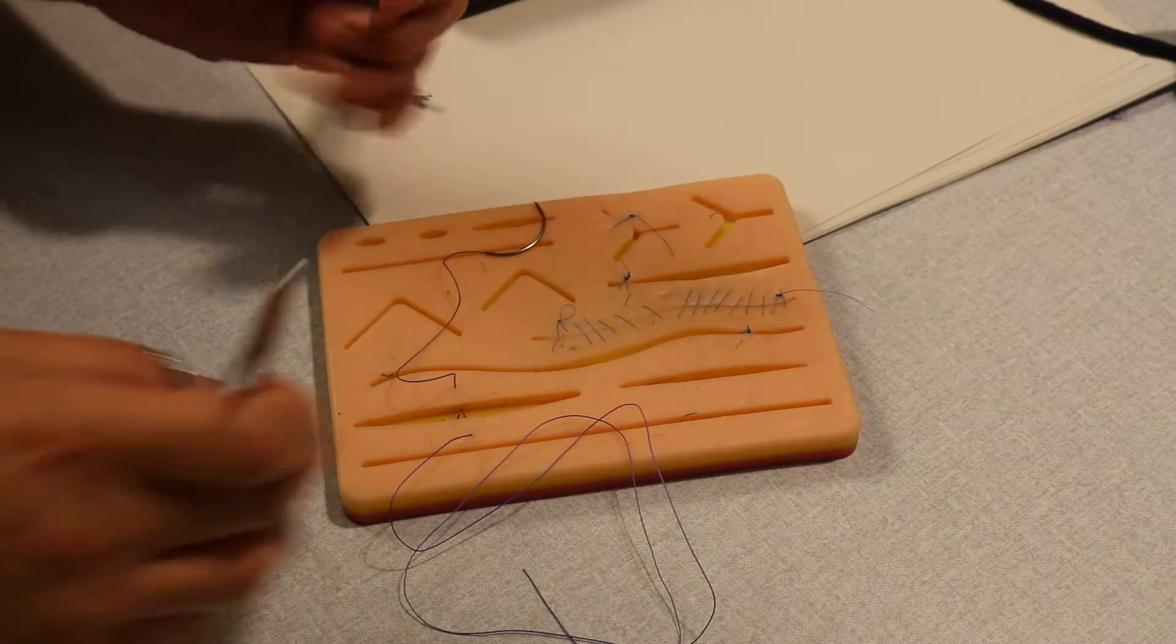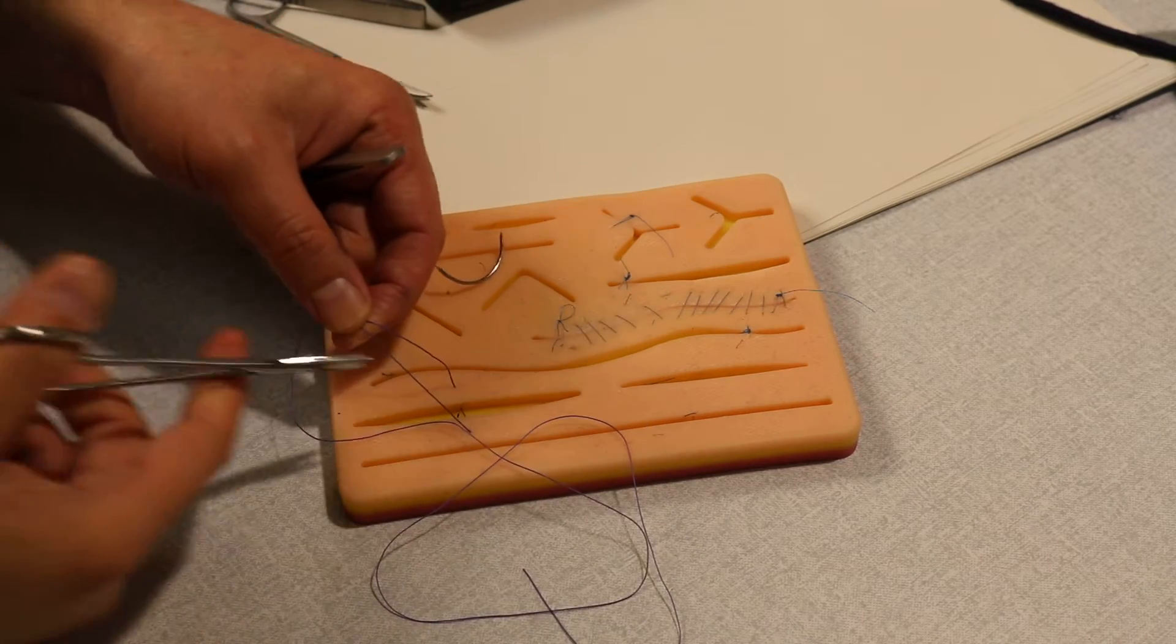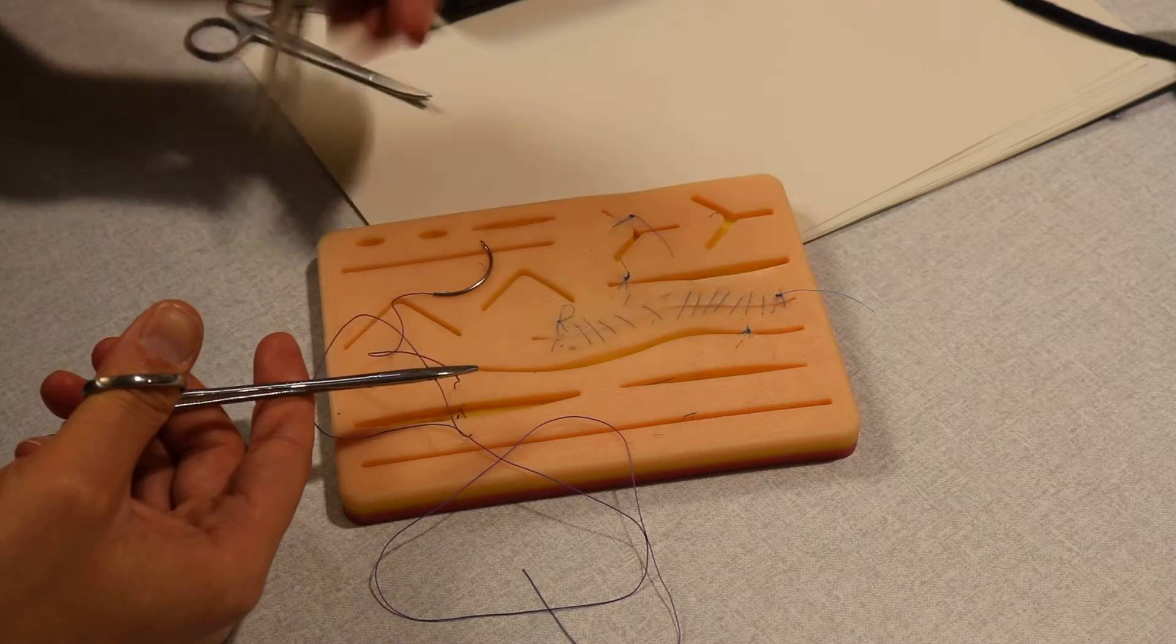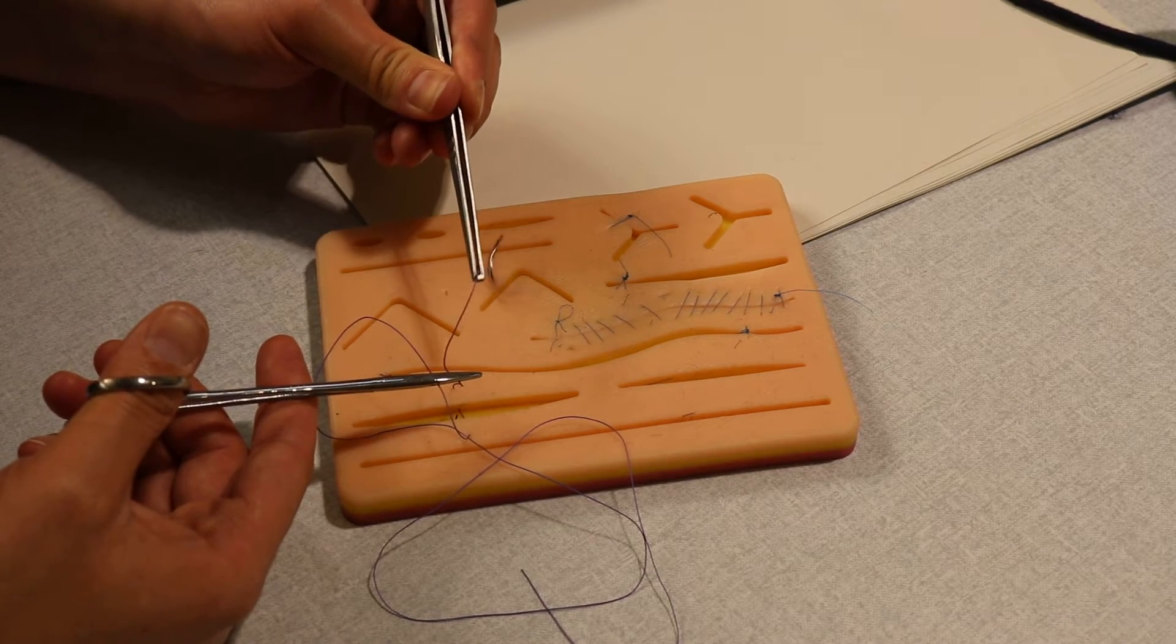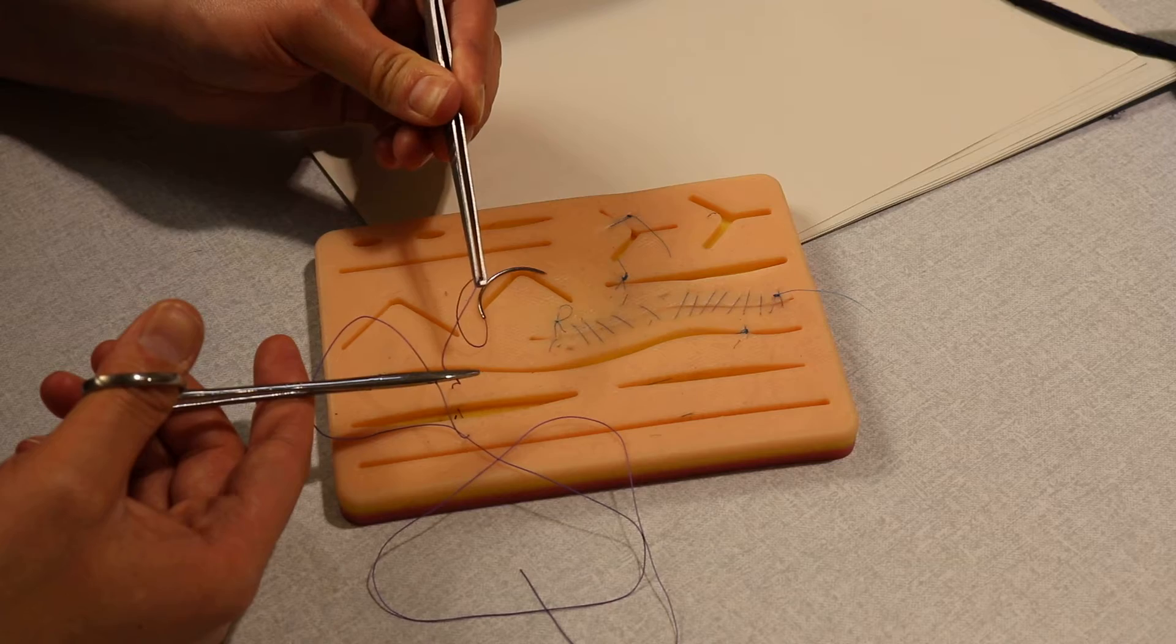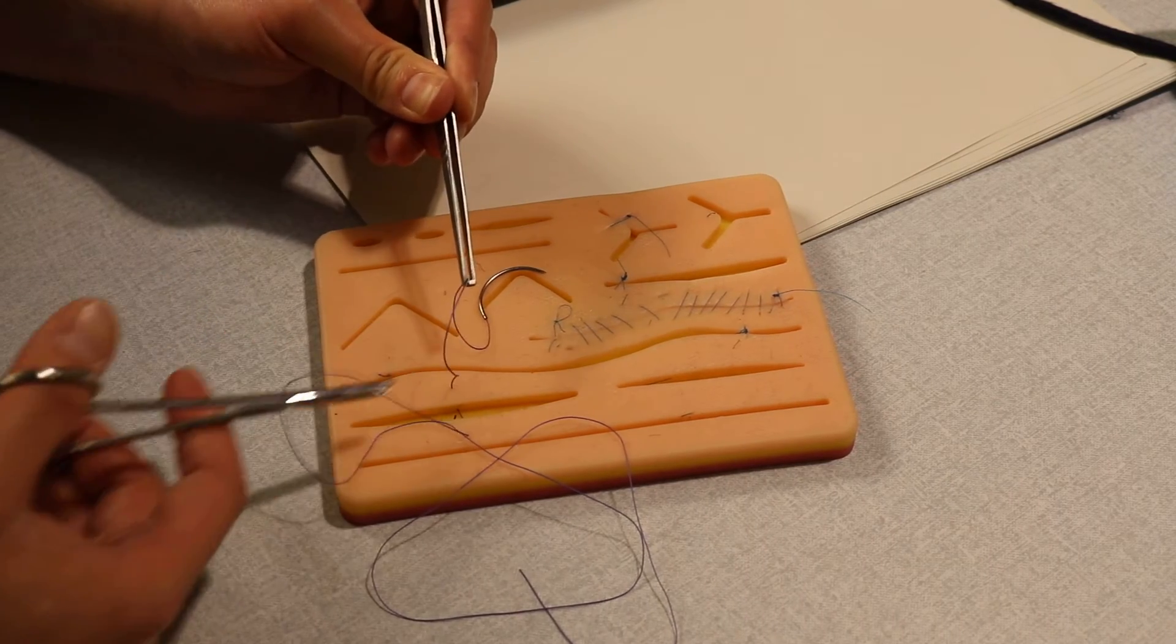If I tie this to this and cut, I can't use that again. I can't take another stitch with this, so I'm not saving money for NHS. I need to save money.